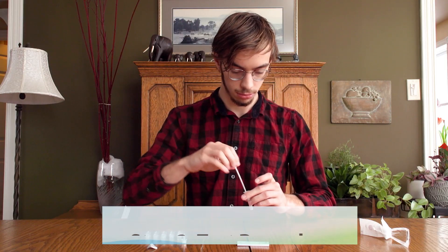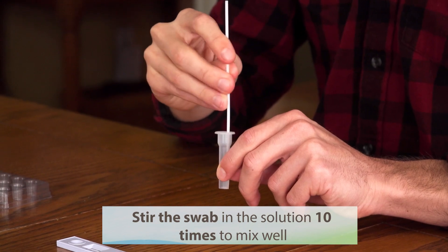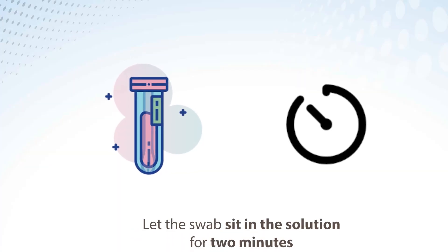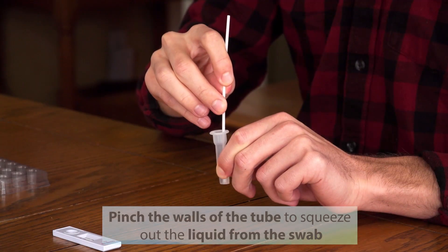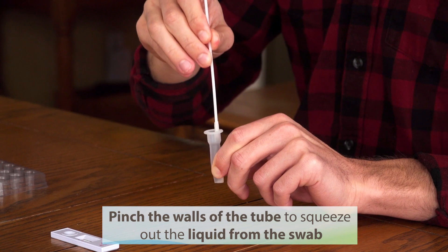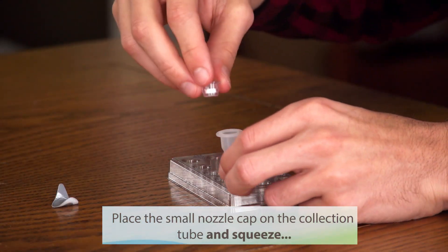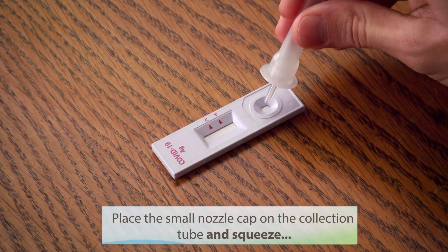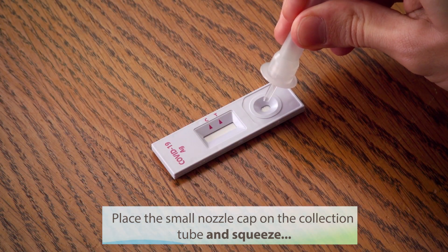Step 3: Test Procedure. Stir the swab in the solution ten times until mixed well. Let the swab sit in the solution for two minutes, then squeeze the walls of the tube to remove any excess liquid from the swab. Place the small nozzle cap on top of the collection tube to seal the sample. Turn the sealed collection tube upside down and squeeze.